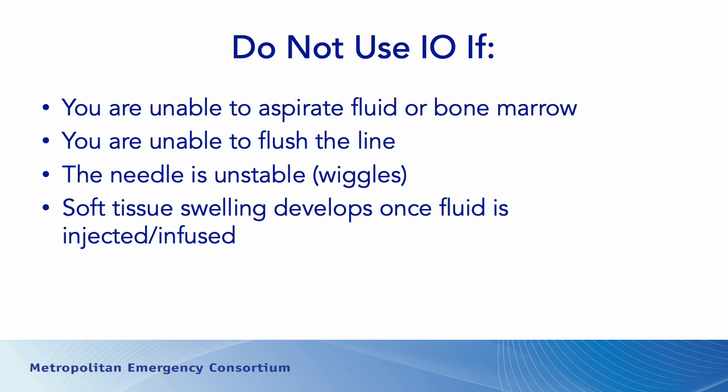And then continue to monitor this device. Check for soft tissue swelling. Make sure that there is no swelling, and if you develop swelling with placement, then stop using it and either take it out or leave it alone. But if you're actively administering medications and fluids and you notice soft tissue swelling, or the device is dislodged or not correctly placed, stop using it. Either leave it alone and let the ED take it out, or take it out in the field.